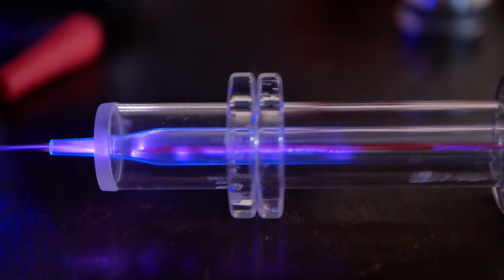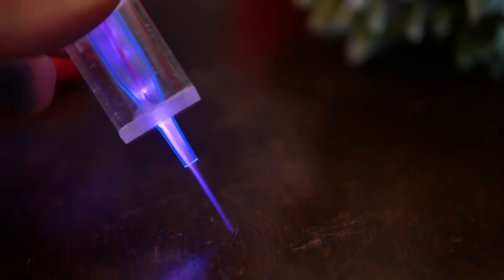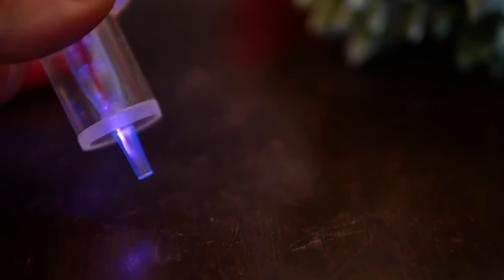So, with the helium flowing, the ionized atoms never really get the chance to heat up. And even if they do, that heat immediately dissipates away. So out comes cold plasma, which is confined to the flow of helium. It's incredibly beautiful.